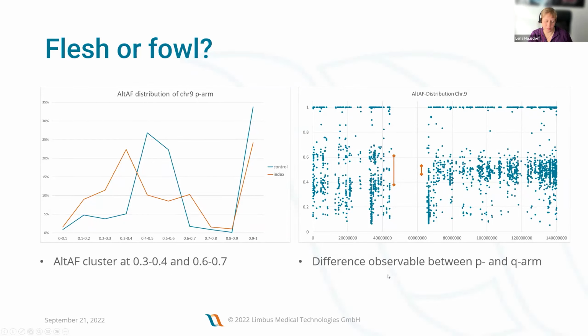And so we went back to the customer and said, okay, we are pretty sure it's a triplication. And they redid the chromosome analysis, and then they could detect it because it's mosaic. What happened was that they used a different type of blood cell for the chromosomal analysis than was predominantly present in the blood sample that was used for the NGS analysis, and therefore they couldn't detect it before.